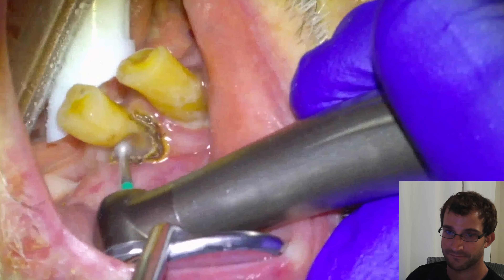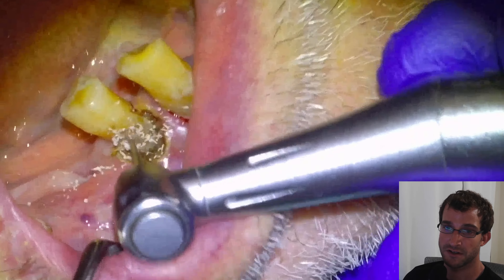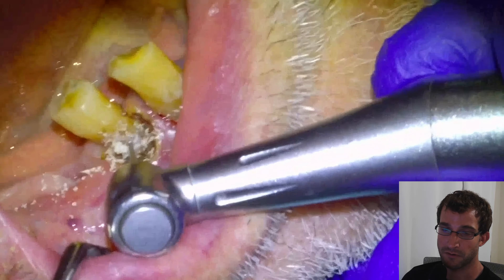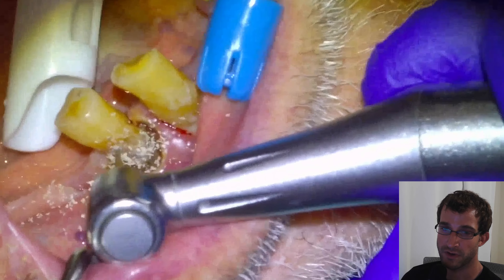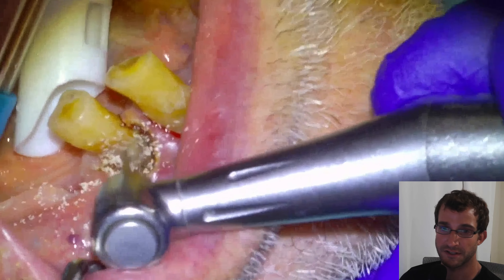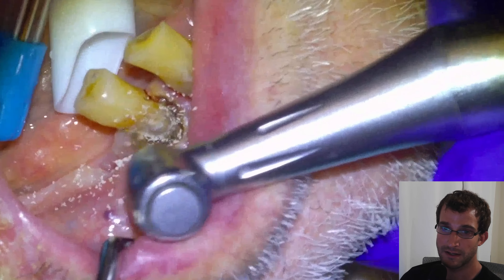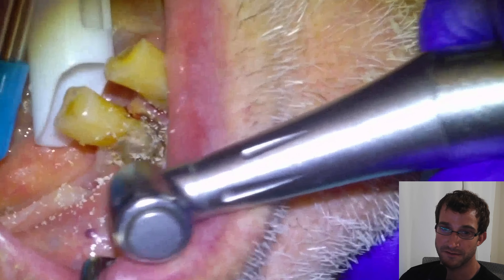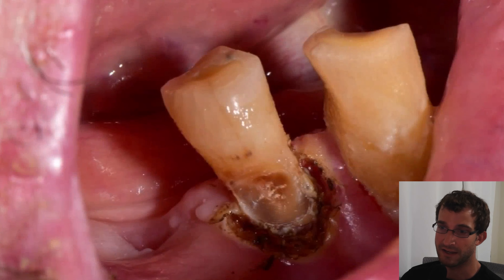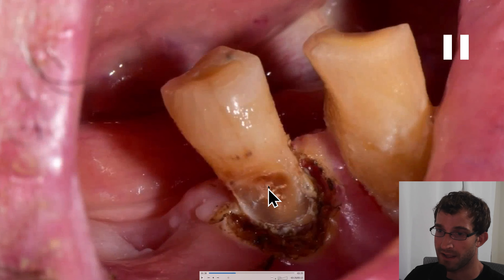Once we have good access to the lesion, we'll use a high speed for the gross reduction and then a slow speed for the fine reduction. This is basically just the part where we are removing soft tooth tissue until it feels hard to tactile sensation with the small slow speed handpiece. I like to use the small round carbide on a slow speed as my caries indicator basically by pressure. Sometimes we'll leave a little bit of affected dentin at the pulpal aspect of the preparation just so that we don't punch into the nerve.